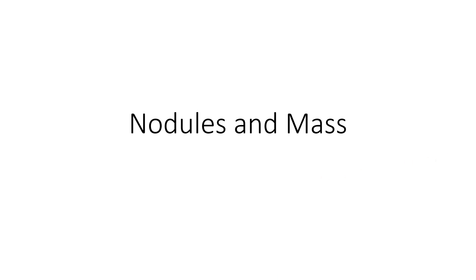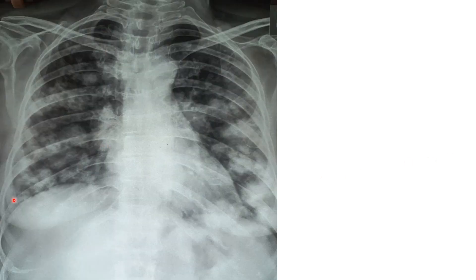Focusing on the lung parenchyma in both lung fields, you can see multiple nodular opacities. A nodule is defined as a round or irregular opacity that is either well-defined or poorly defined, but less than three centimeters in diameter. If it is greater than three centimeters in diameter, it is referred to as a mass lesion. In this X-ray you can see many nodules.